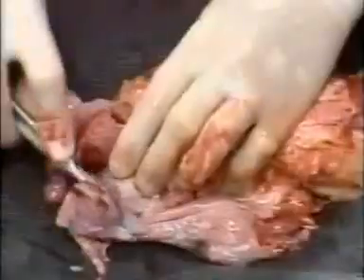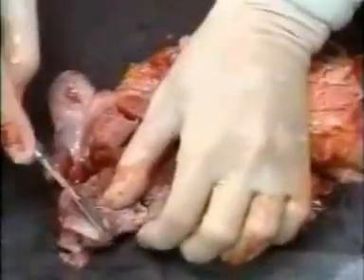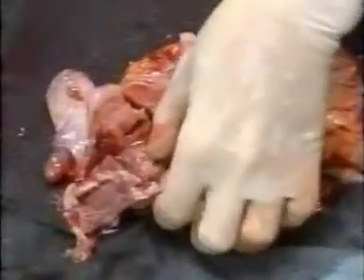Oh, she has a little leiomyoma. This is a benign muscle tumor of the uterine wall.